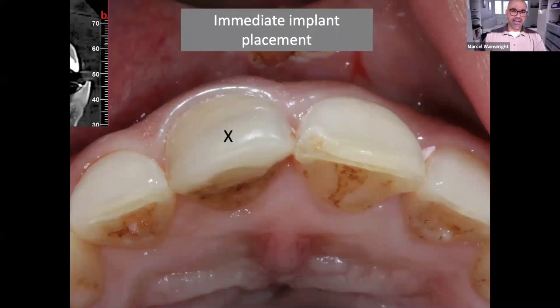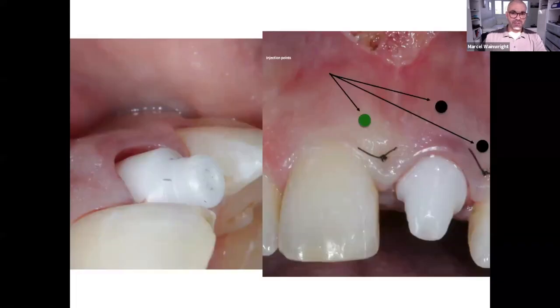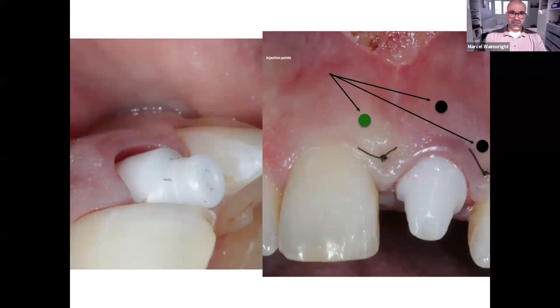Here we see another clinical case of immediate implant placement. This is the upper view, displaying the soft tissue thickness and volume of bone. We placed an immediate implant and injected hyaluronic acid inside the tissue using a sharp needle.